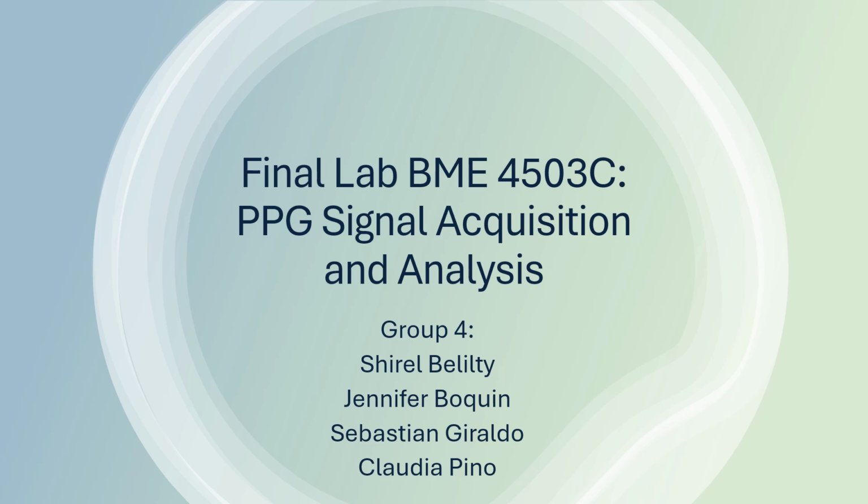Hello, we're group number 4, and today we'll be presenting our final lab on PPG signal acquisition and analysis. These projects integrate ECG and PPG signals to analyze cardiovascular health, calculate pulse transit time, and determine arterial stiffness using pulse wave velocity.